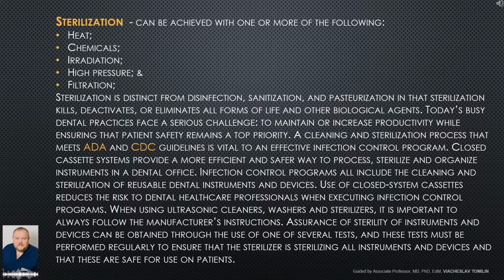Infection control programs all include the cleaning and sterilization of reusable dental instruments and devices. Care must be taken by the dental healthcare professional to ensure that all instruments are cleaned prior to sterilization, and that this is carried out in a safe manner to avoid injury and puncture wounds. Use of closed-system cassettes reduces the risk to dental healthcare professionals when executing infection control programs.